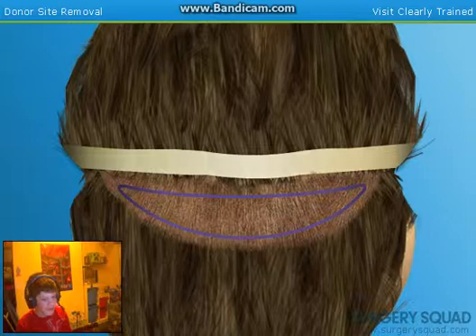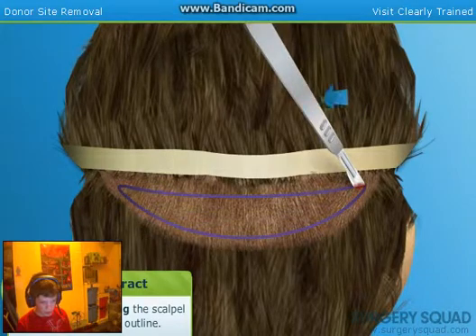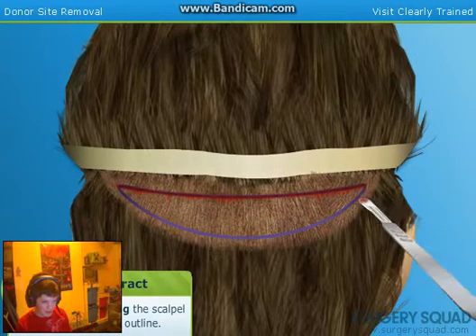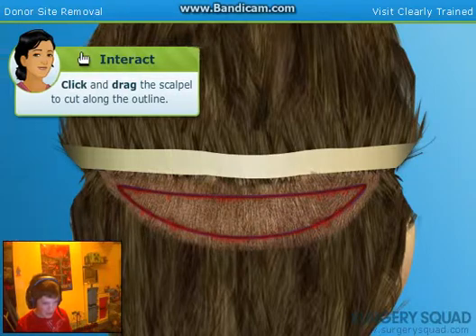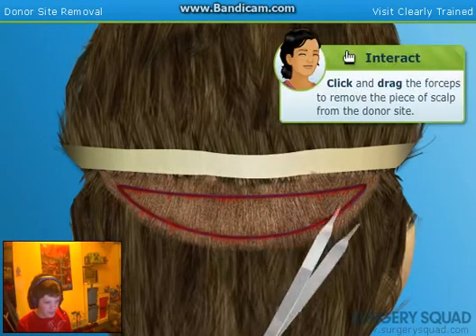Now we'll need to remove the piece of scalp we outlined from the donor site. Use the scalpel and cut along the line to begin the process. Next, we remove the piece of scalp from the donor site. Make sure you have a good grip.